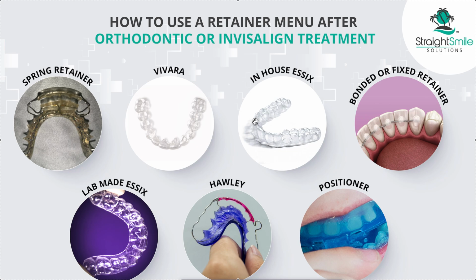And lots of labs. The Orthodontic Lab is one of my favorite labs. They're very affordable. I think they may also have packages. And it's really nice if you get the printed model too, because then if you ever need to make another one, you have it. Or you can give it to the patient and say, hey, if you ever lose yours, bring this back and we'll do it at a very low cost. That way they don't have to get remolded, which should always be an additional fee if it is.